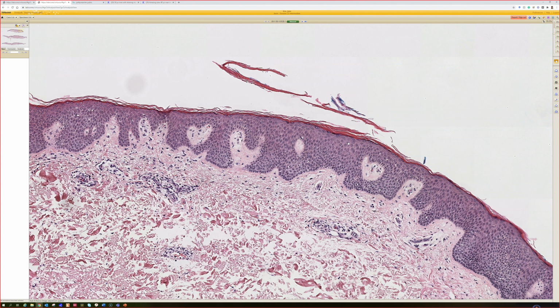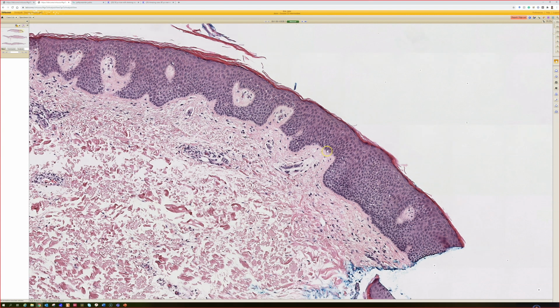I also sometimes think of TMEP, telangiectasia macularis eruptiva perstans, a subtle adult form of mastocytosis. Here, I think there is some spongiosis. So I would say my first thought here is that this may be a spongiotic dermatitis. It surprisingly has very little inflammation.